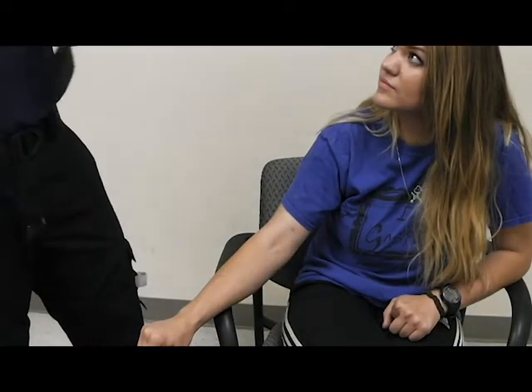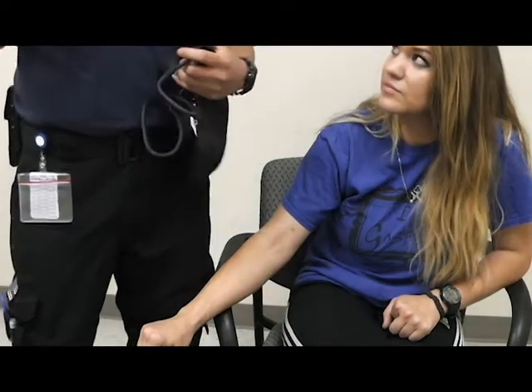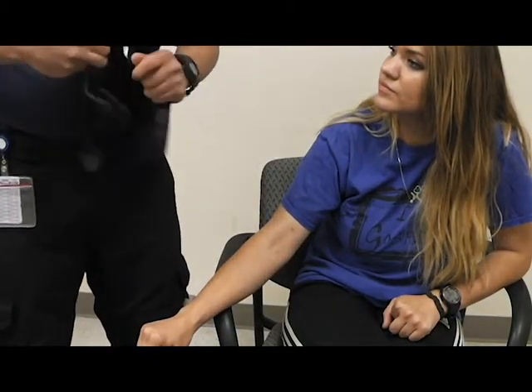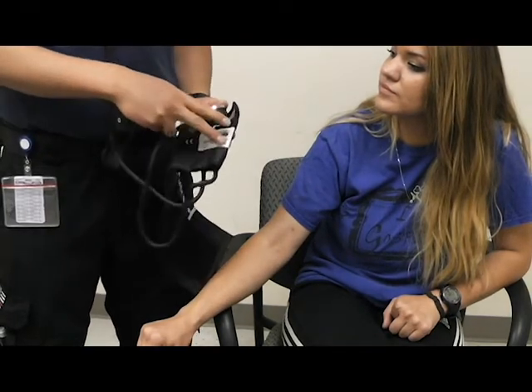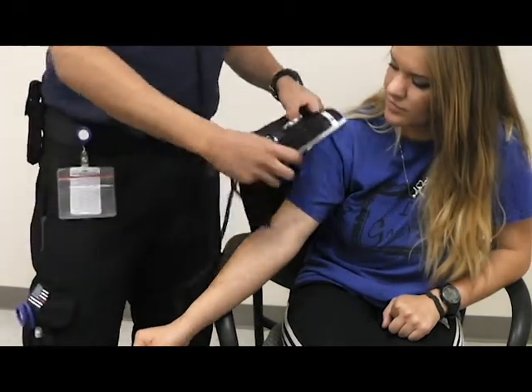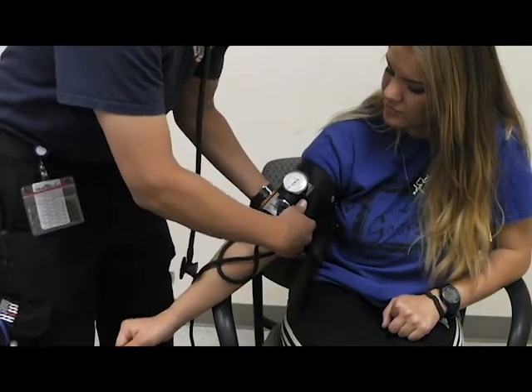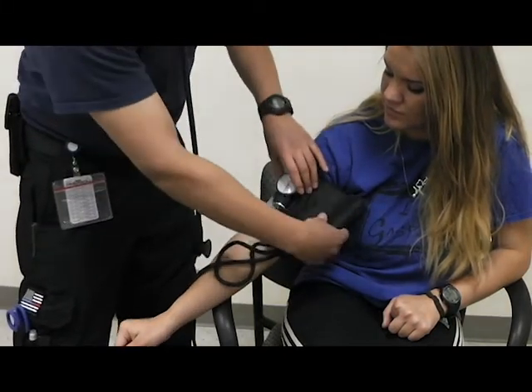First, test your stethoscope and make sure it's working. If it is, you can set that to the side. For your blood pressure cuff, you'll have your dial, and you'll need to find two markings on the cuff — one will say left arm, one will say right arm. You want to line that up with the patient's right arm or left arm artery. Line it up, place it in the right position, tighten, and place the flap right behind it so you can read your dial.